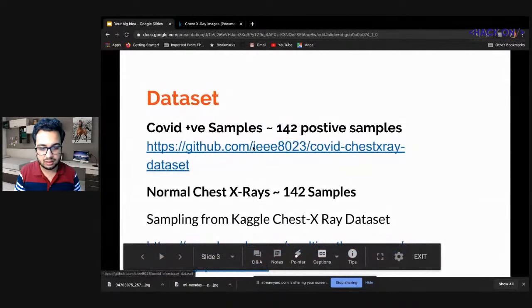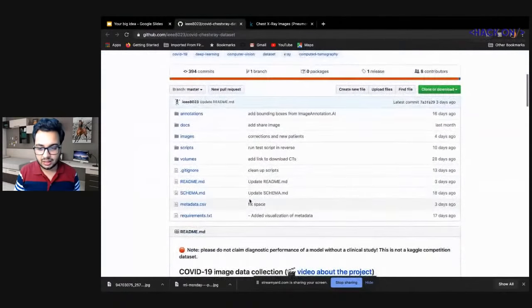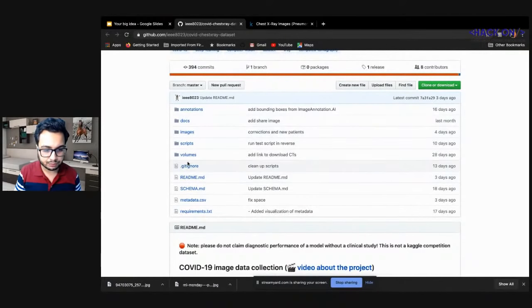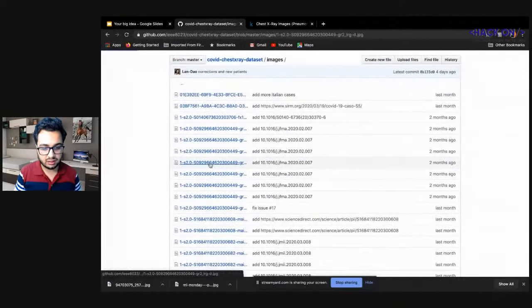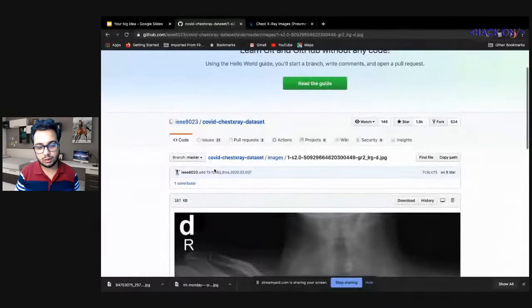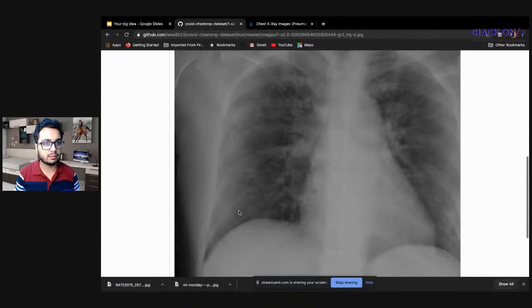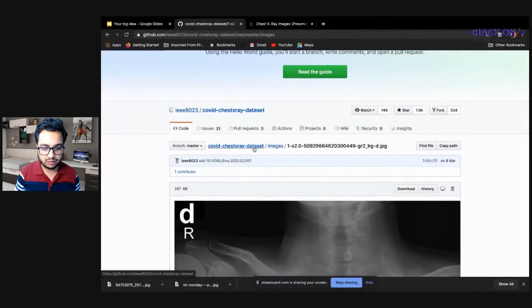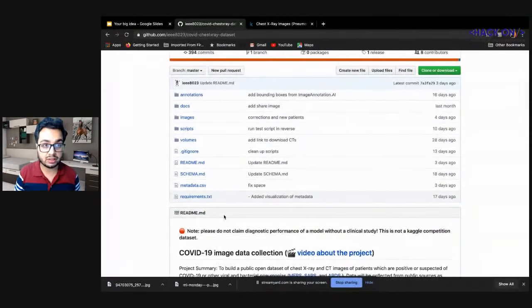We took images from the GitHub dataset — it's an active project, updated almost every day — with X-rays of COVID patients. You just download the GitHub repository to get the data, and from that we need to do some extraction as well.